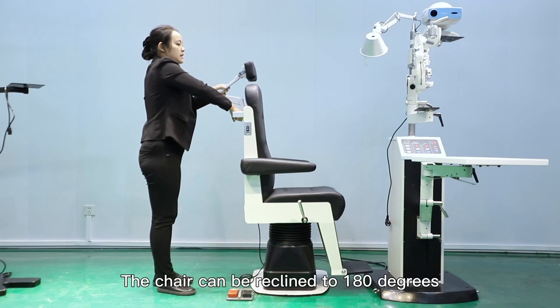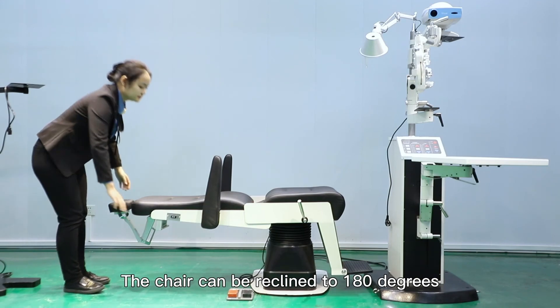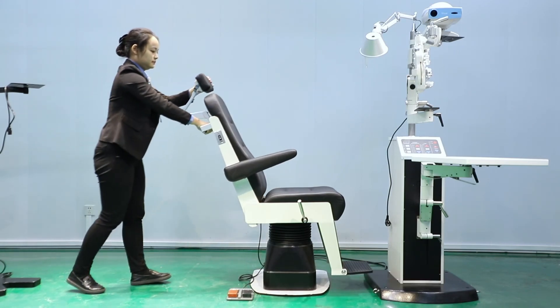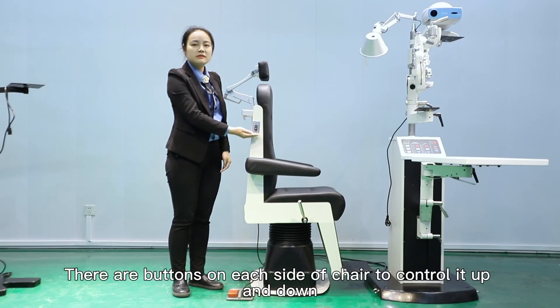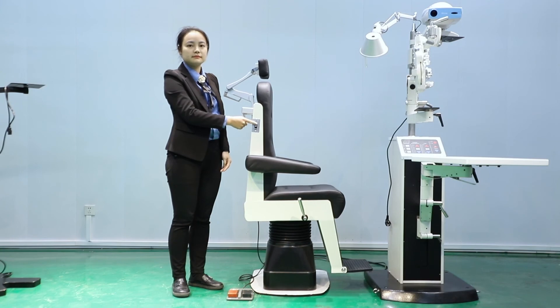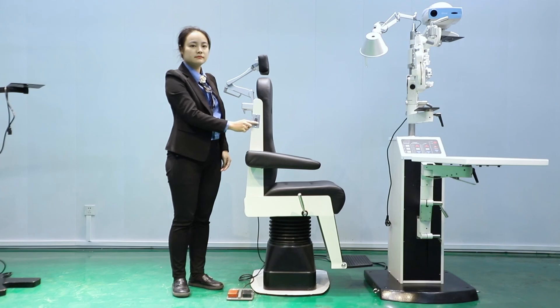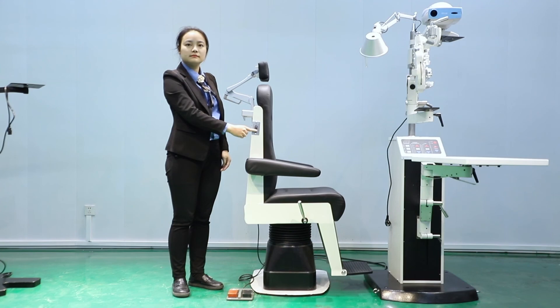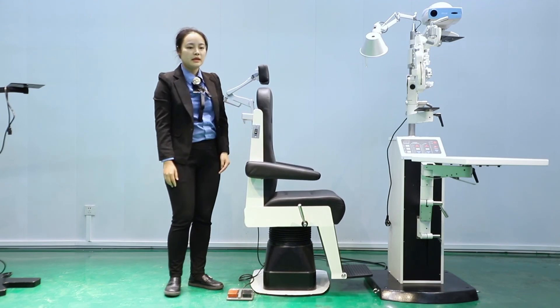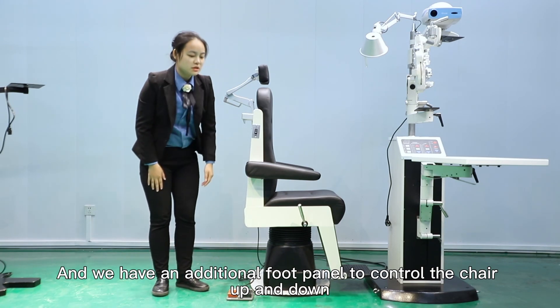The chair can be reclined to 180 degrees. There are buttons on each side of the chair to control it up and down. We also have an additional foot panel to control the chair up and down.